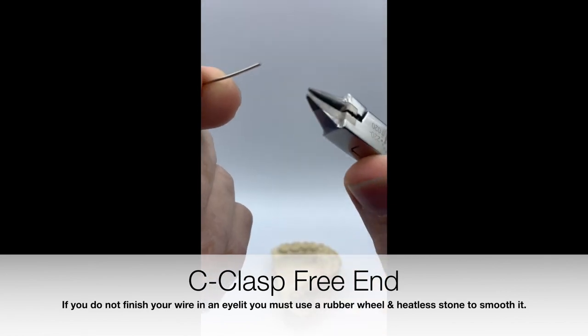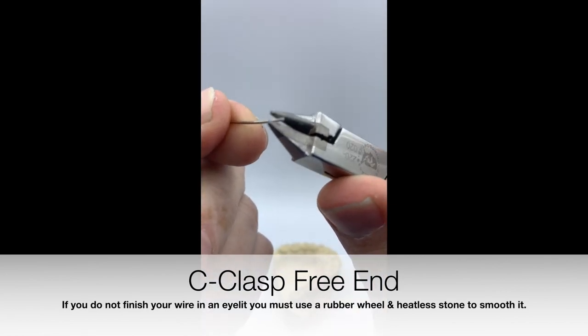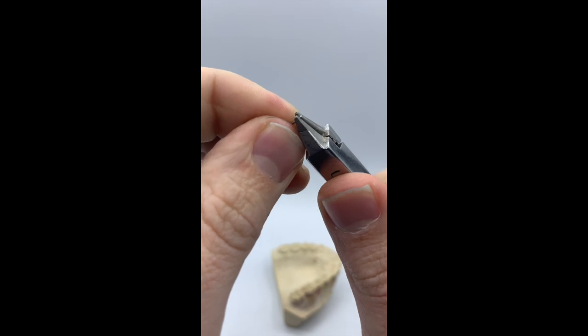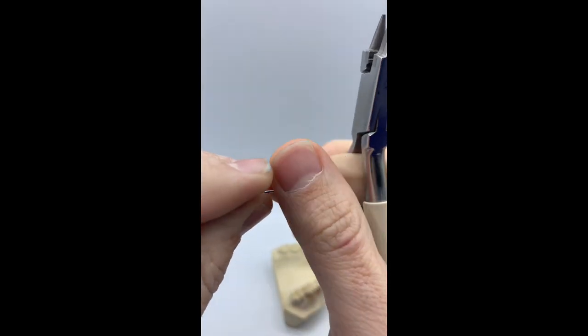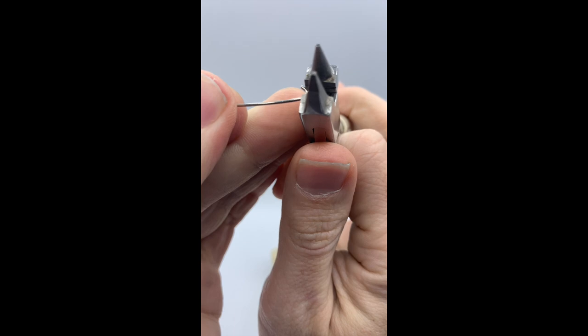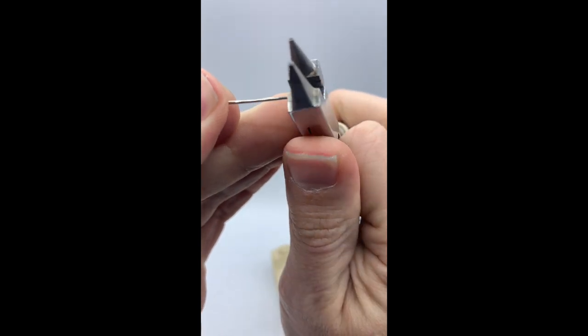Every technician will finish the edge of the wire differently. This here is how to make an eyelet. It's a short bend and then you squeeze the edge with your plier. This will give you a smooth finish.